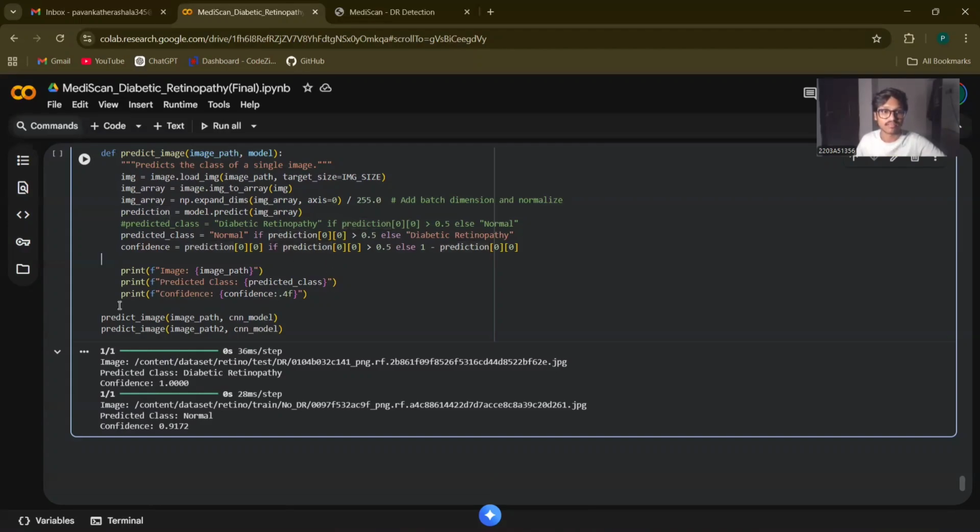Then next, running our diagnosis. These final lines call the function on our two test images. The system prints a clear, human-readable result: the image file and the quantitative assessment of the patient's retinal image. This final function encapsulates the power of our AI. It takes a raw image, transforms it into a numerical format the CNN understands, and provides an instant, evidence-based diagnosis with a quantified confidence score. This demonstrates the model's immediate value as a diagnostic assistant.